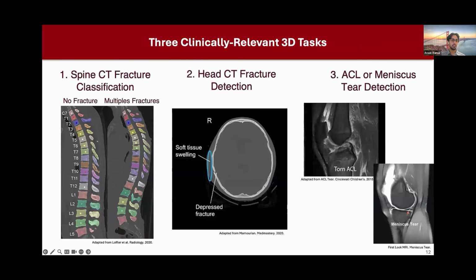Yeah, I can answer it. So I can talk about it in the 3D setting. I actually manually looked at some of these fractures, and you can visually identify some of them. So they're not super fine-grained fractures in which they're not fully noticeable. But what they do have is that they span multiple slices. So it allows us to assess whether, if in just one slice, you lose that information, or whether if you use a lot of these 3D approaches, it's able to actually preserve that volumetric consistency of having that fracture span multiple slices.